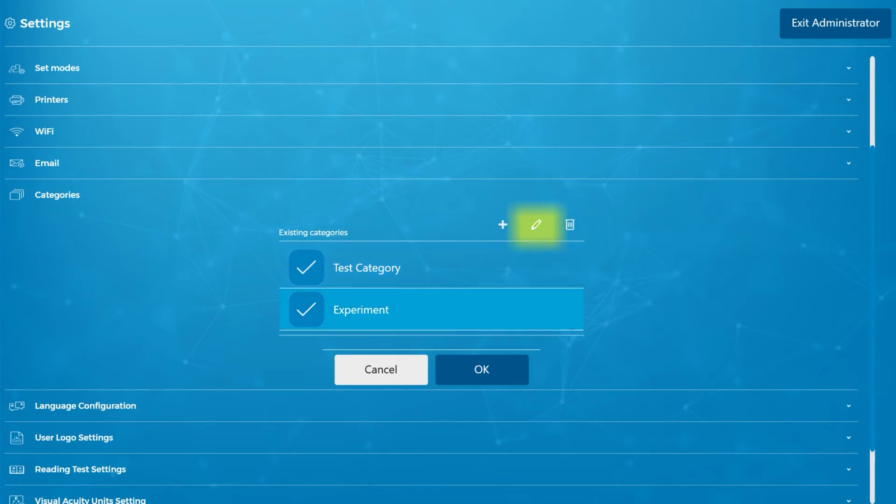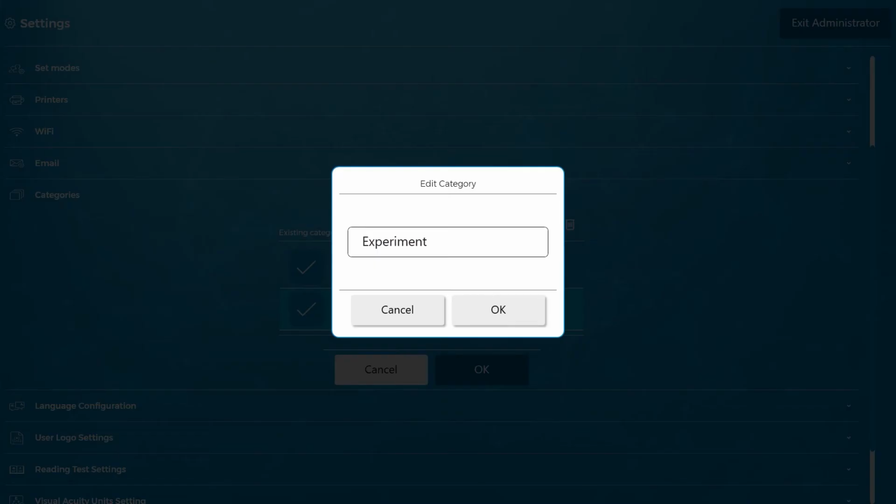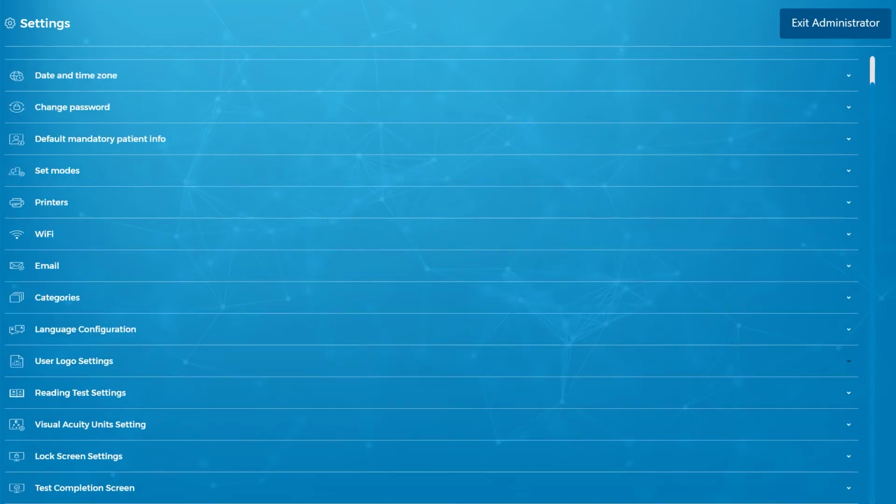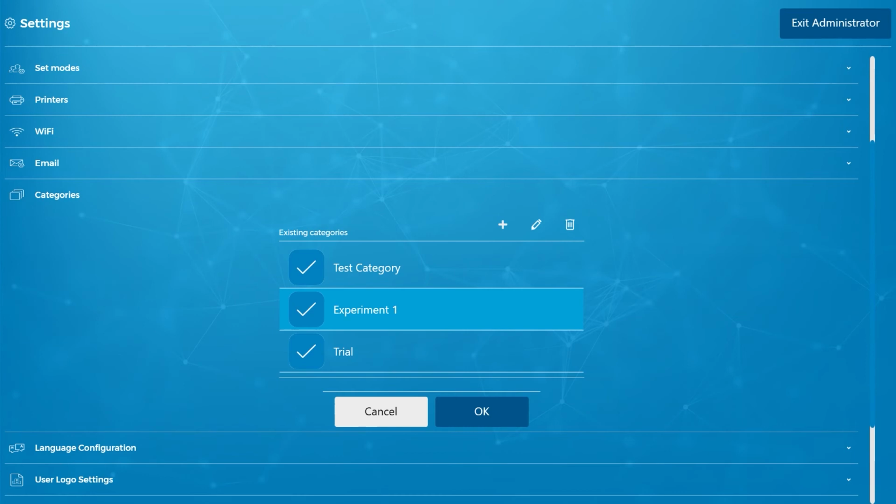Edit your groups by clicking on the section and then on the Edit icon. Click on the Delete button to delete categories. If you choose to display only some of the categories, you can temporarily remove them by clicking on the checkmark button.